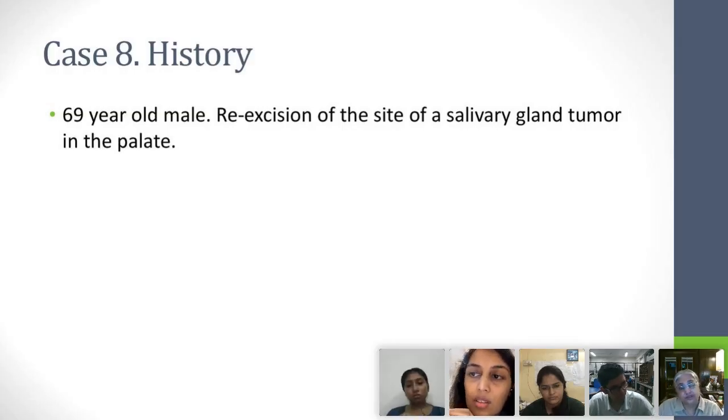Okay, Kshitija? Ma'am, it is a minor salivary gland tumor, and some tumors are malignant by their nature. Maybe in the first excision, what diagnosis was given, that was a malignant tumor. I see, okay. What about you, Neha? Ma'am, it could either be a recurrence or some change happening in that post-op site, or something that is remaining, or some other change, or a totally new tumor also.